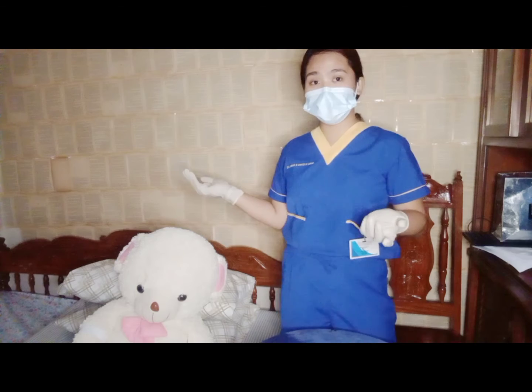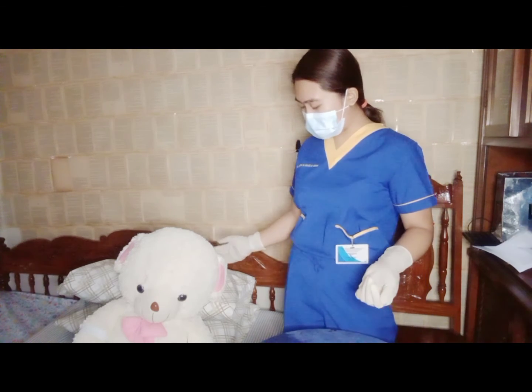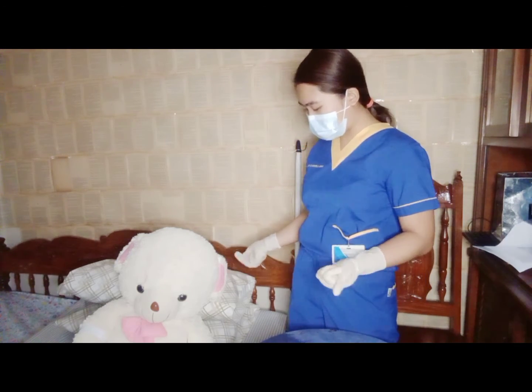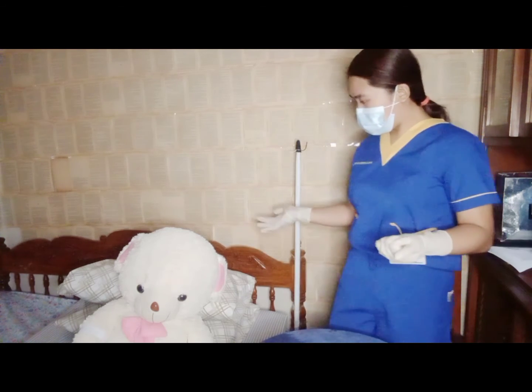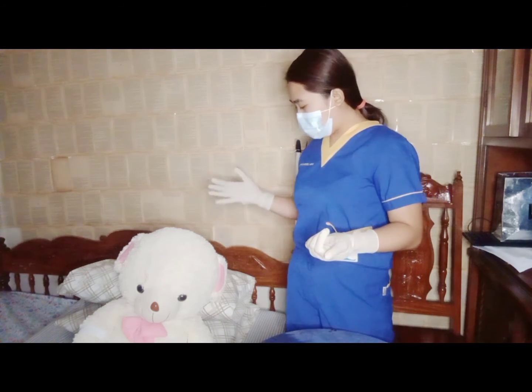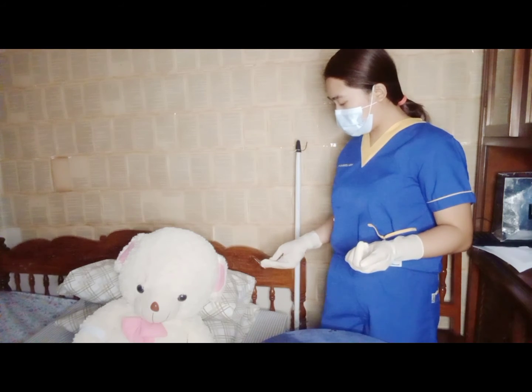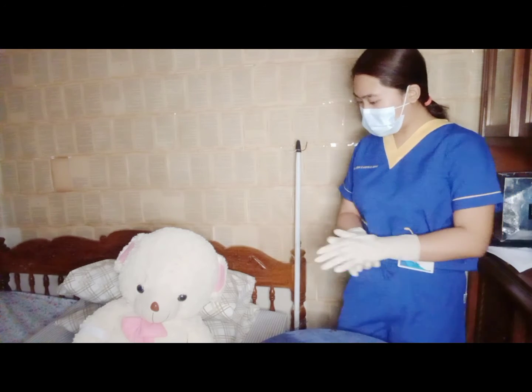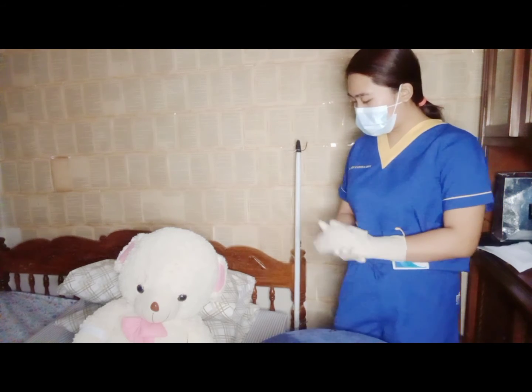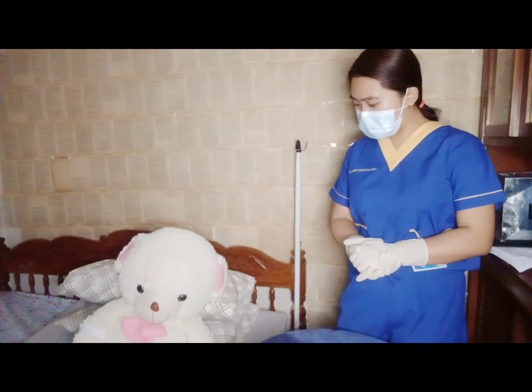So, let's position our patient to a comfortable position. Ma'am, ayos lang po ba yung kalagayan niyo? Wala po bang masakit sa inyo? Okay, very good. Gusto niyo po bang itulungan ko kayong humiga or uupo na lang po kayo? Okay po, so comfortable po ba kayo sa ganyan? Sa pag-upo ninyo? Okay lang po ba kayo sa position na yan?